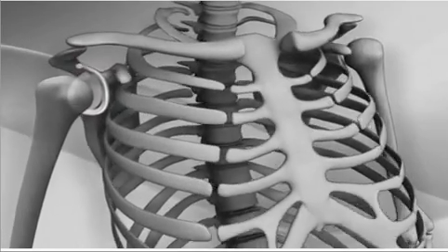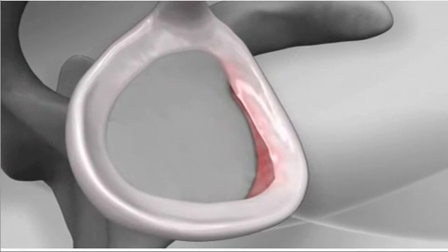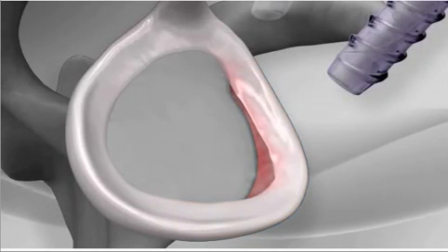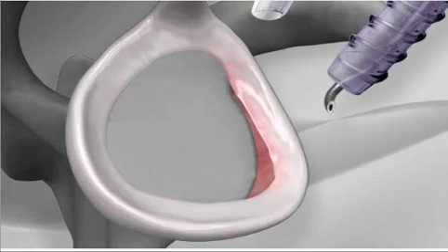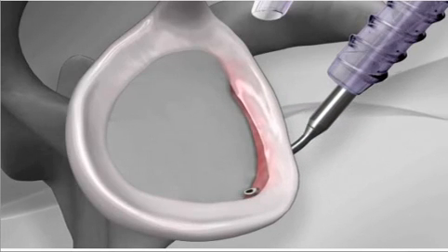The push lock is a device designed to repair cartilage tears in the shoulder. The surgeon begins by identifying the cartilage tear and inserting 2 cannulas into the shoulder. A suture passing device is placed between the cartilage, or labrum, and the shoulder socket, or glenoid.